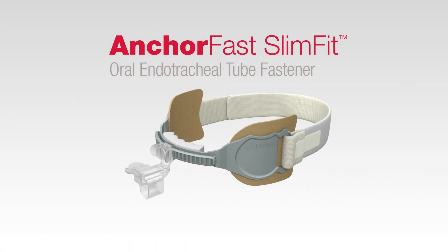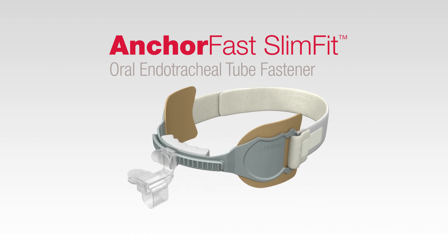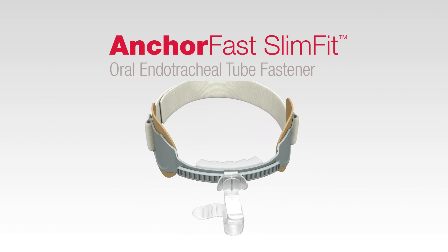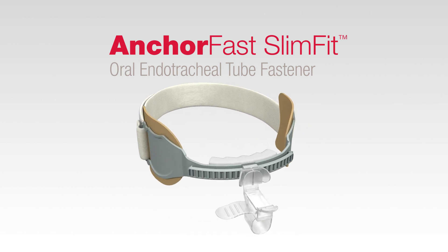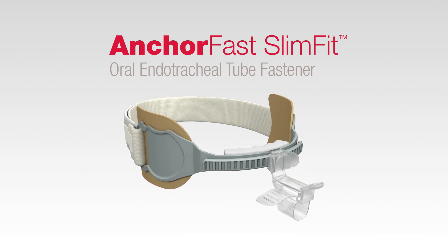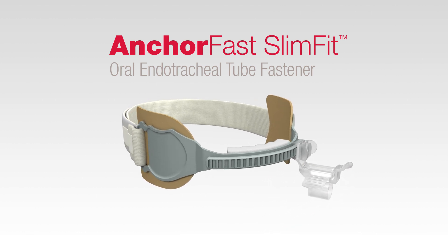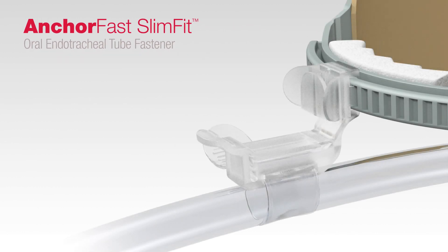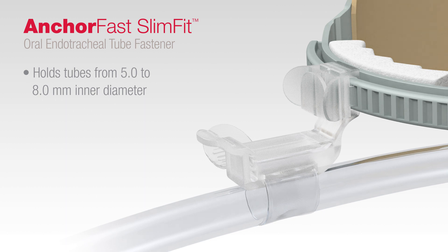The AnkerFast Slim Fit Oral Endotracheal Tube Fastener provides a convenient means to hold an oral endotracheal or ET tube securely in place without the use of adhesive tape. The oral endotracheal tube fastener allows repositioning of the ET tube in either direction along the track without removal of the device. It holds tubes securely ranging in size from 5.0 to 8.0 millimeters inner diameter.